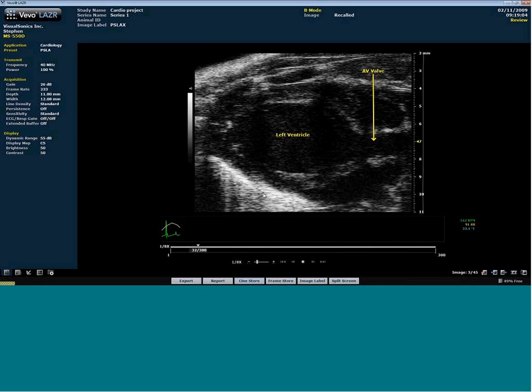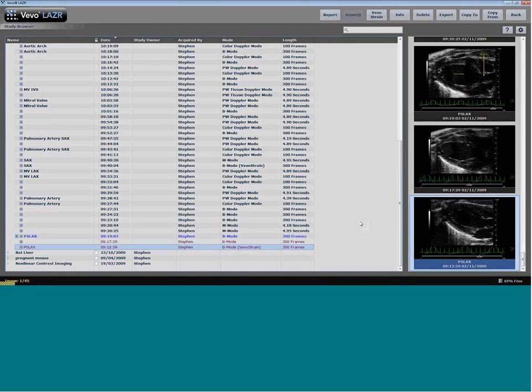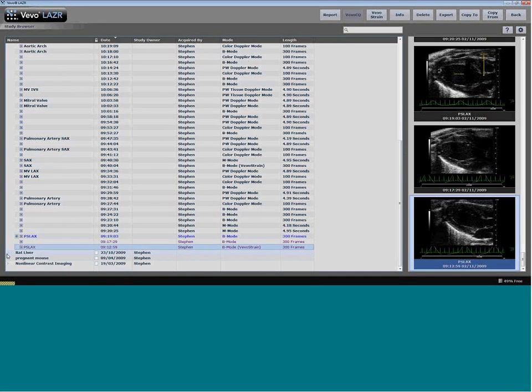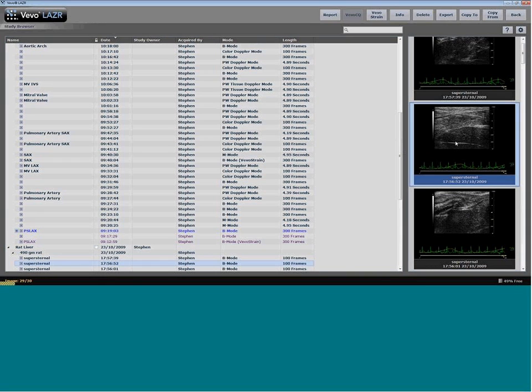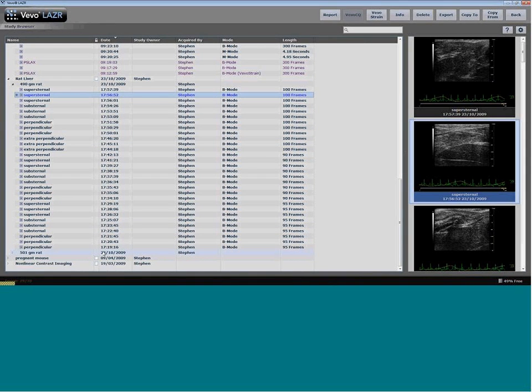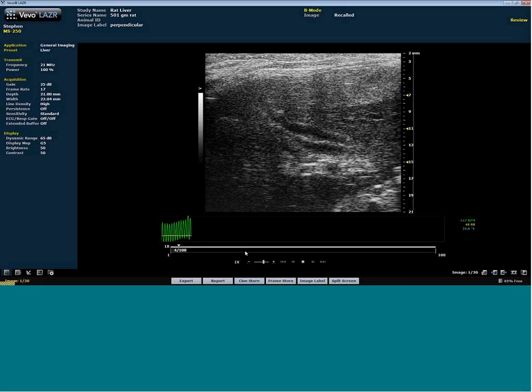So I'll move on to another question that was sent in earlier. This is also a two-part question, specifically about rat imaging. I'm just realizing right now that I don't think I have any rat cardio, but I do have some rat livers, so not exactly within the area that we want to look at, but I will bring up one image just to point something out. That's actually not what I was expecting. Let me try something else.